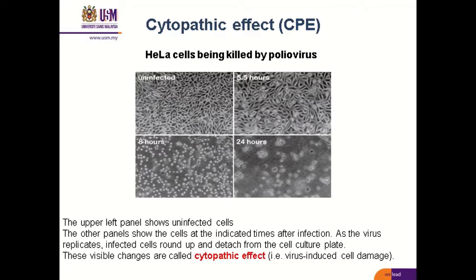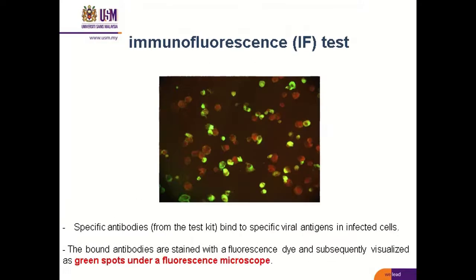This cytopathic effect is different between the different viruses. So the type of CPE will indicate what type of virus is present.